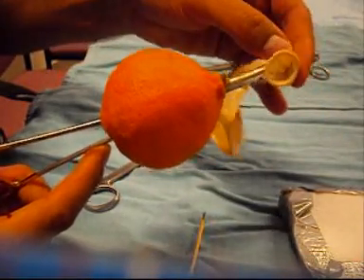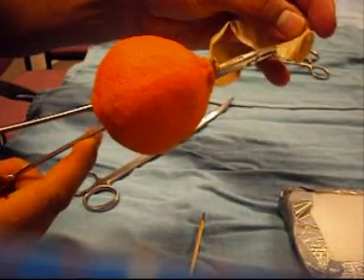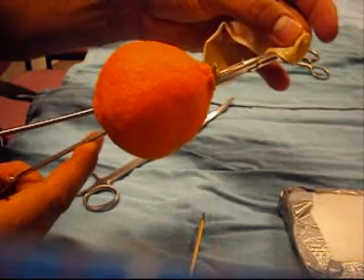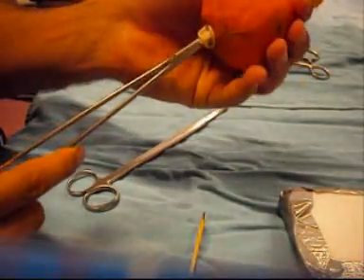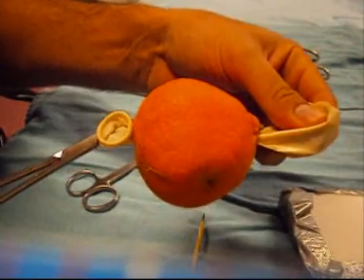We then carefully grasp the party balloon all the way across, which we then drag through. This is now the urethra of the model.